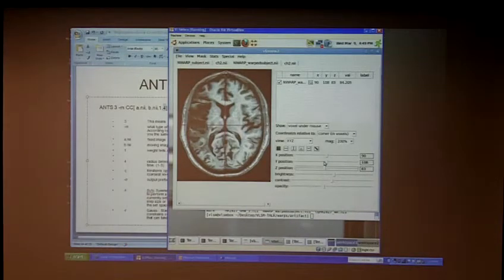Yeah. I also would put good money on it not mattering, all the work that Grant does getting these equations exactly right. Because the only thing that ultimately matters when you're doing a VLSM analysis is if it moves the border of a lesion to somewhere else. And every time you move the border of a lesion, it's making a change in one subject in two different little chunks. So unless you have some systematic thing that's going to move that same border in the same direction in more than one subject, in a way that also correlates with your task, it's really unlikely to matter that much.